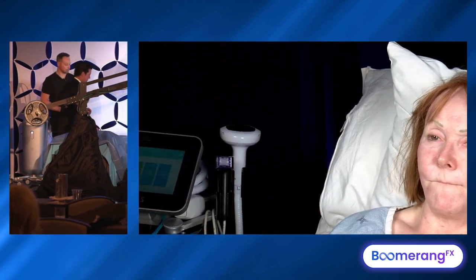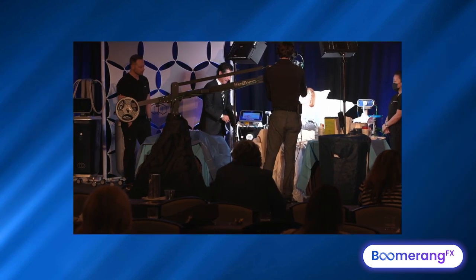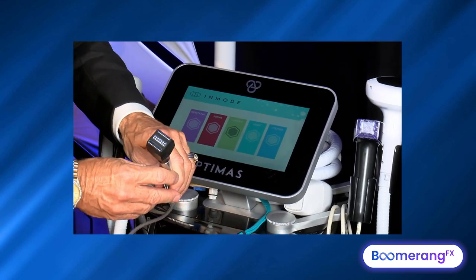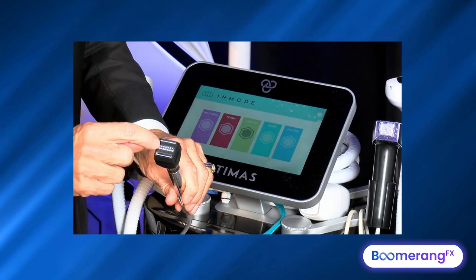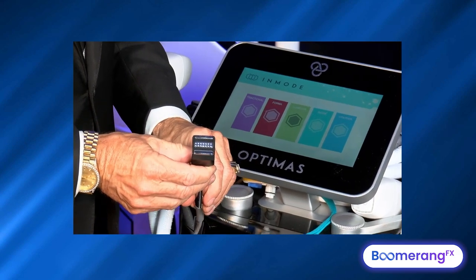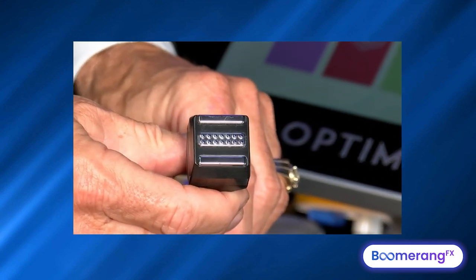This is the Optimas system. We've already looked at the Lumecca. Now we're going to go to the RF plugs in the back and use this little device called the Forma. This is what the Forma looks like. There are smooth electrodes — 14 of them, seven on one row and seven on the other — and the RF flows from positive to negative.